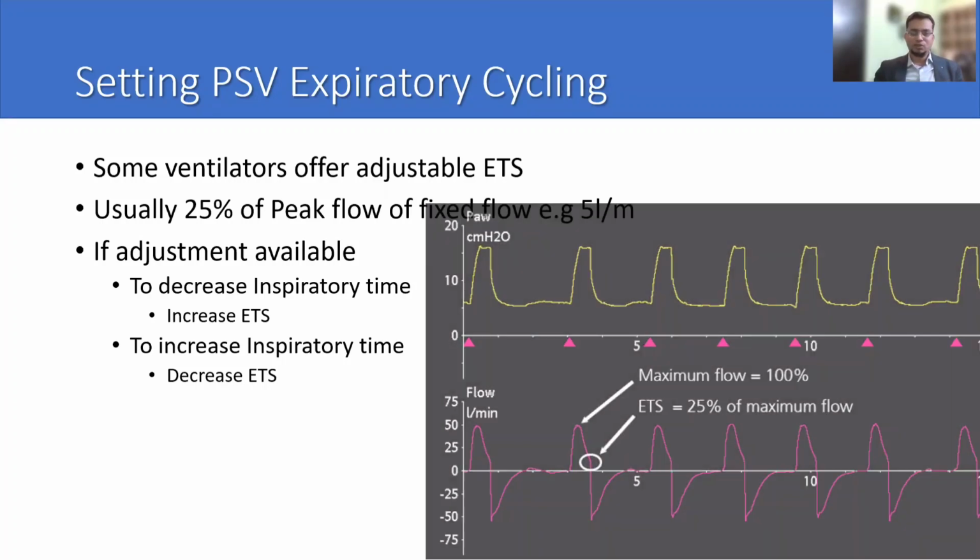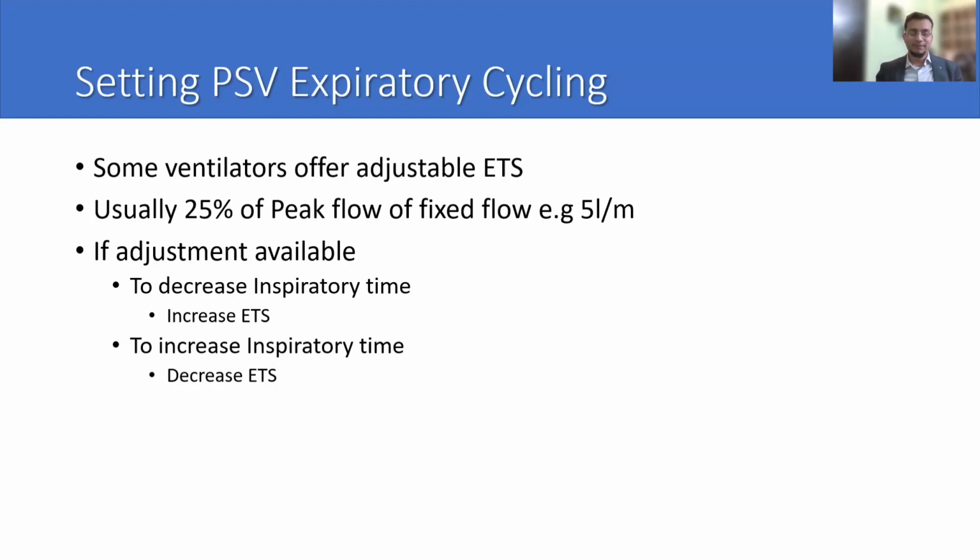In a COPD patient, we increase the ETS. It will cycle early, which is desirable in COPD because it will give you an expanded, or increased, expiratory time.